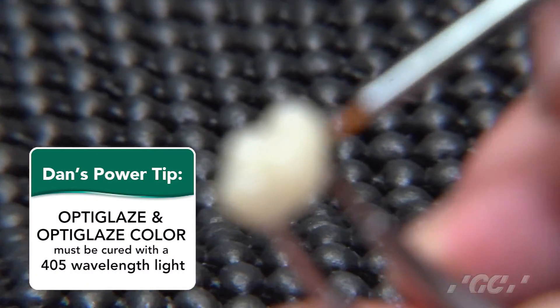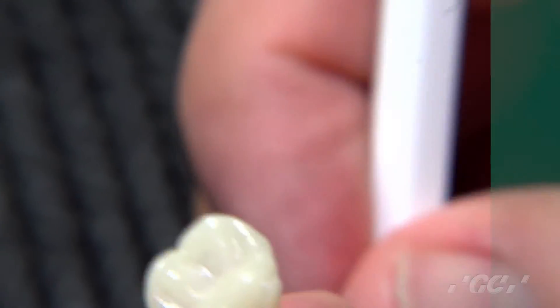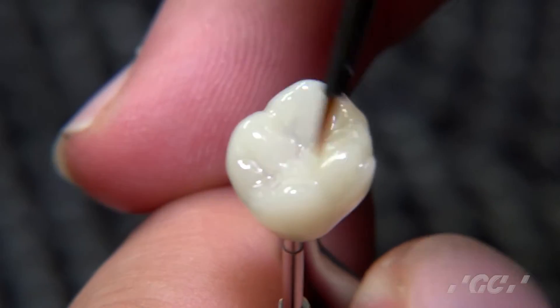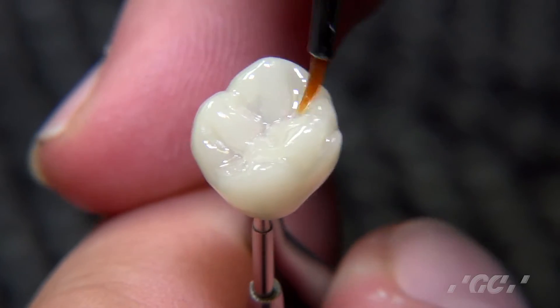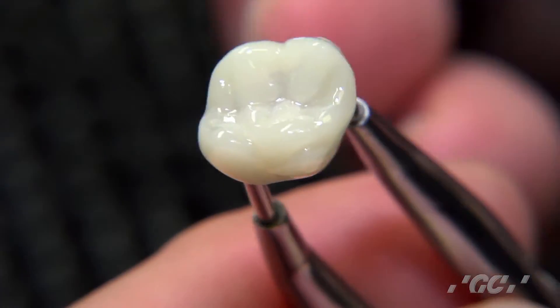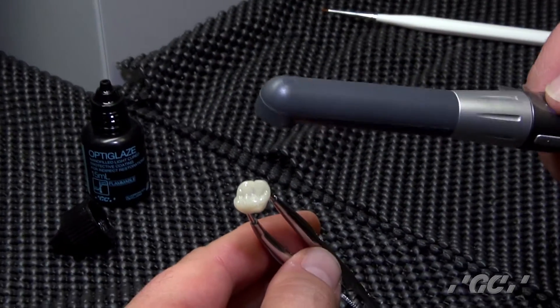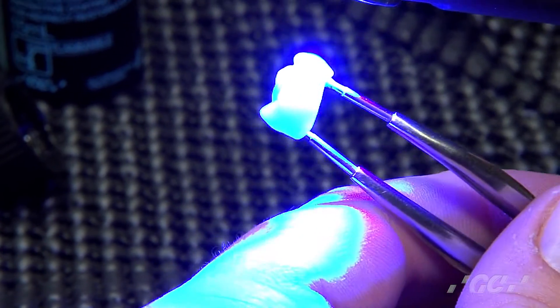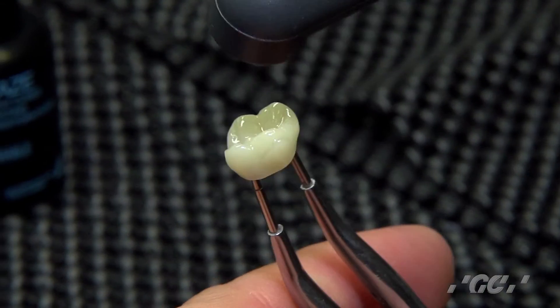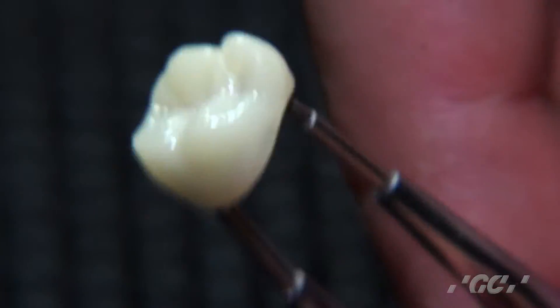The OptiGlaze can be cured with any light that has a 405 nanometer wavelength — you could use lab lights. GC offers a light called the Labolite, or you can use different handheld lights, just make sure they have a 405 wavelength. It's as easy as light curing the surface for 40 seconds. As you're light curing, make sure you rotate the crown to get all the different angles — the occlusal surface, the mesial, the distal. As you can see, you get a really beautiful gloss and luster on the surface of the Cerismart restoration.